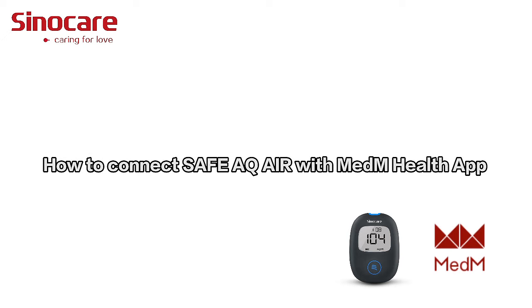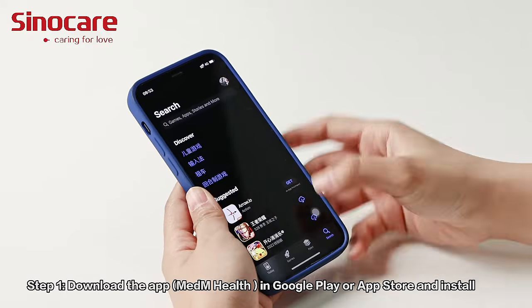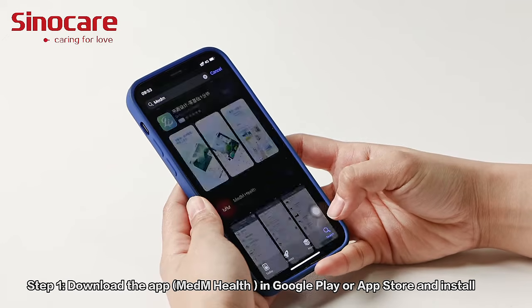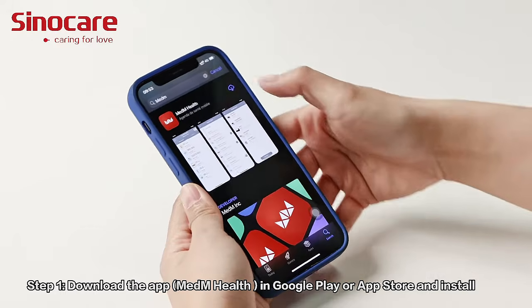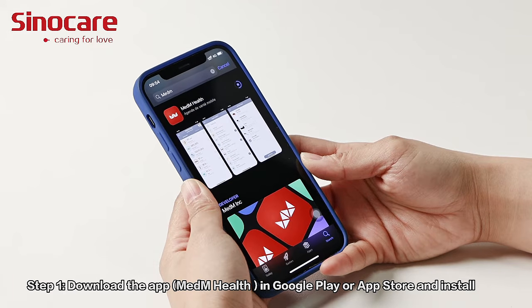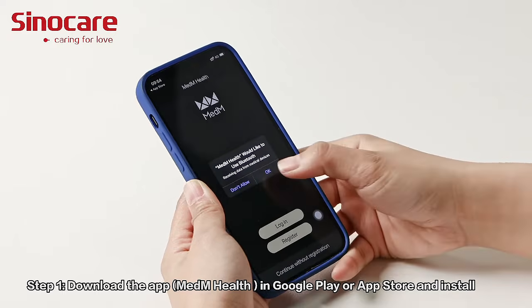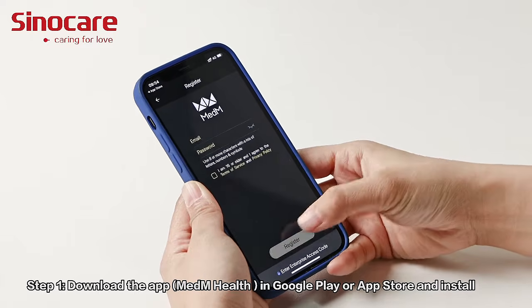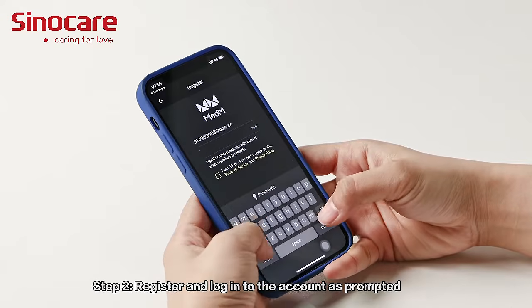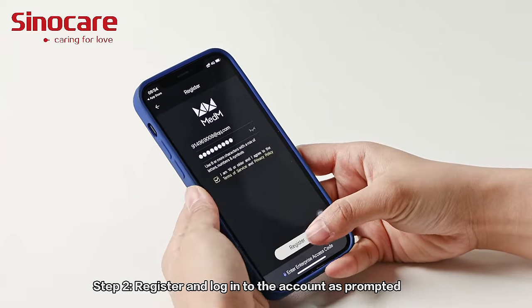How to connect SafeAQAir with MedM Health app. Step 1. Download the app MedM Health in Google Play or App Store and install. Step 2. Register and log in the account as prompted.